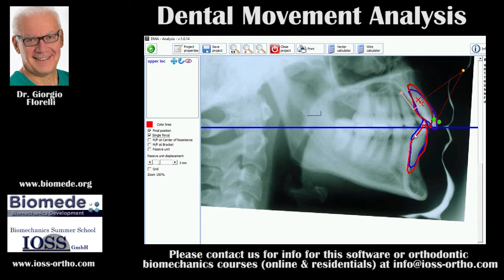If I click here, here is the line of action of the force I have to use. You can play with this as much as you like to find the force system that you need. For me this is a very clear indication — I don't need to do the DMA for this kind of movement, which is very straightforward. But for my students it is important because they see the relation between the movement and the force system. These arrows represent the needed single force vector, telling you that you need to use a cantilever configuration for intrusion and retraction.